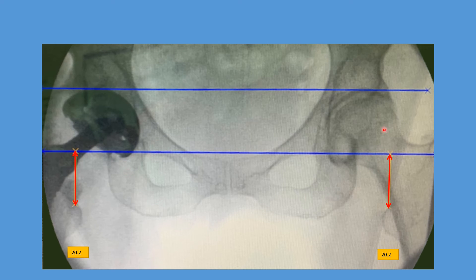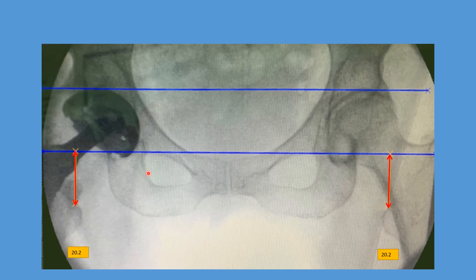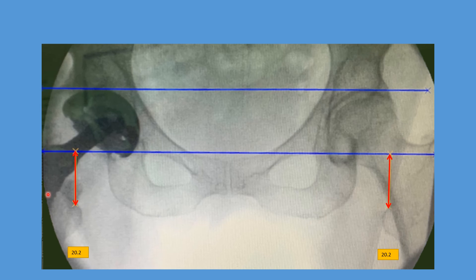This is a critical, very important confirmatory x-ray. Here we have the pelvis, and this image is taken with our fluoroscopic system and then downloaded into our computer guidance system. We have the appropriate symmetry between the two sides, the appropriate angulation and rotation, and we begin taking measurements — drawing horizontal lines across common landmarks to ensure a level pelvis. On the right side, the hip we've corrected, we can see our socket or new acetabulum in place, the femoral stem, and the neck geometry we have chosen. Using this combination of components, we have now reproduced the targeted length: on the healthy left side we have 20.2 millimeters, and using this combination of implants we have 20.2 millimeters of height — correcting all of the original deformity.